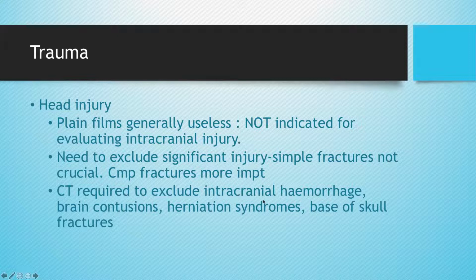So all of the blood that you're looking for, you could actually find it on MR, but MR is not readily available. It's very slow, and it's not conducive to the trauma patient from the point of view of, if you have any life support equipment, they can't go in there, and it takes too long, and the patients probably can't cooperate very well. So CT is frontline in trauma for all different body parts.